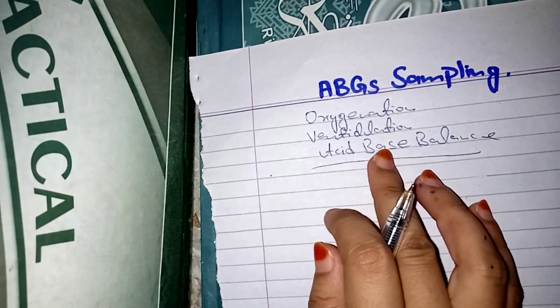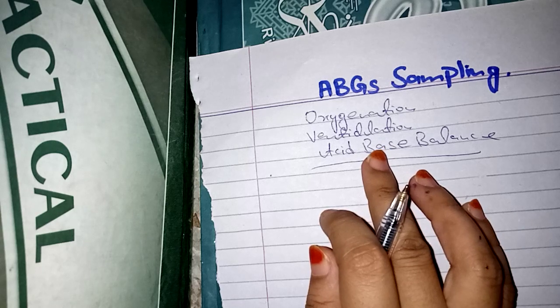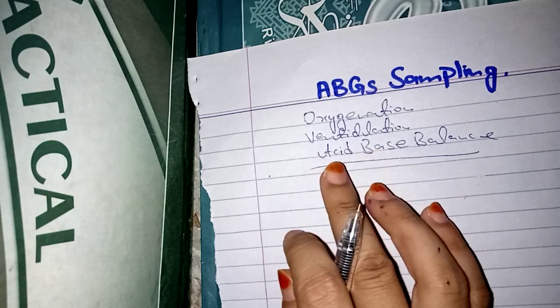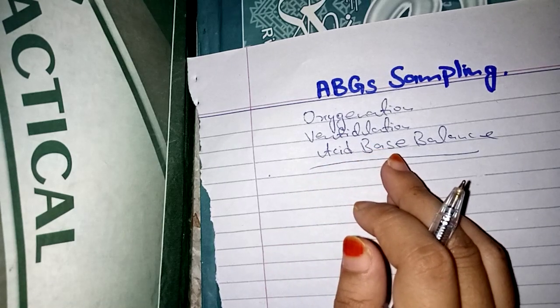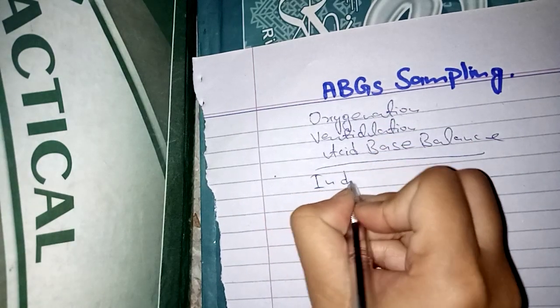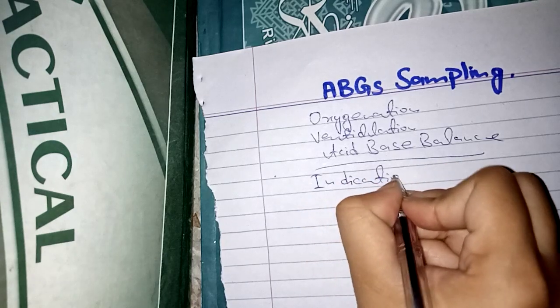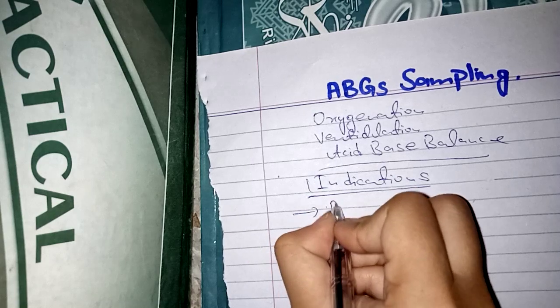Before taking an ABG sample, you should properly take consent from the patient and explain to his attendant about the indications. In indications, you should explain why it is needed: due to respiratory pathology.